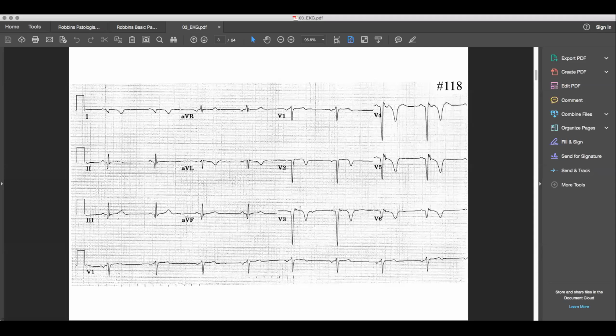I don't know if it's already visible. Almost. We can see your name. And now I can see your tracing as well. Okay. Perfect. I'm sorry, it's just taking a little while. Relax. Be patient. Yes. Okay.